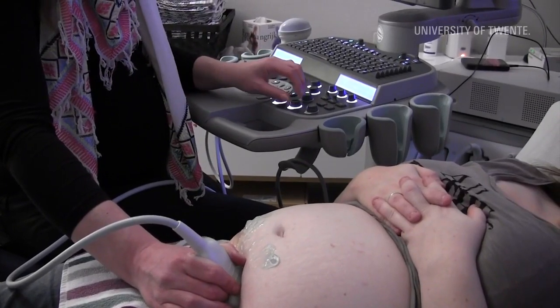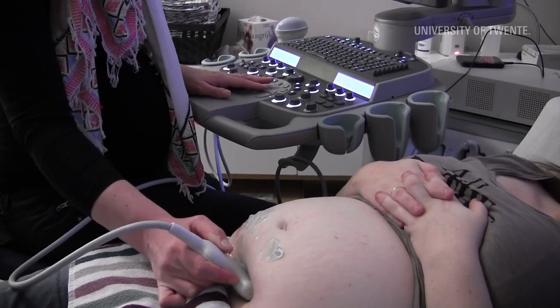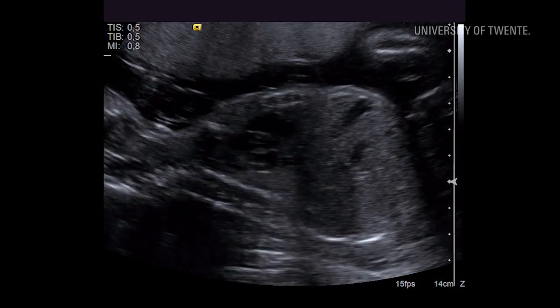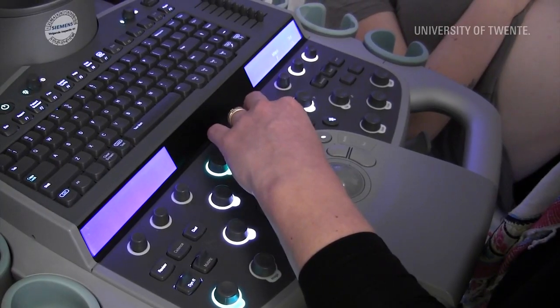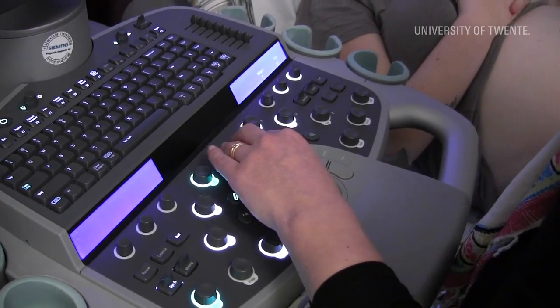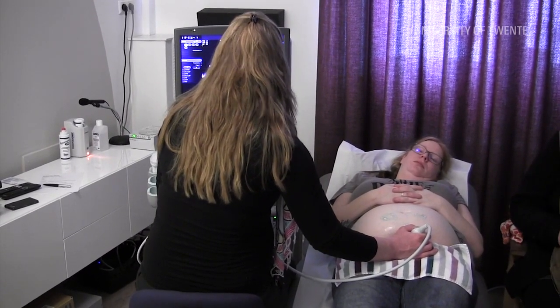We will use the convex probe and begin, of course, with application of the ultrasound gel. Important to know is that the fetal heart beats at approximately 160 beats per minute at this age. This is a really important aspect we need to consider in choosing our image parameters as optimally as possible.